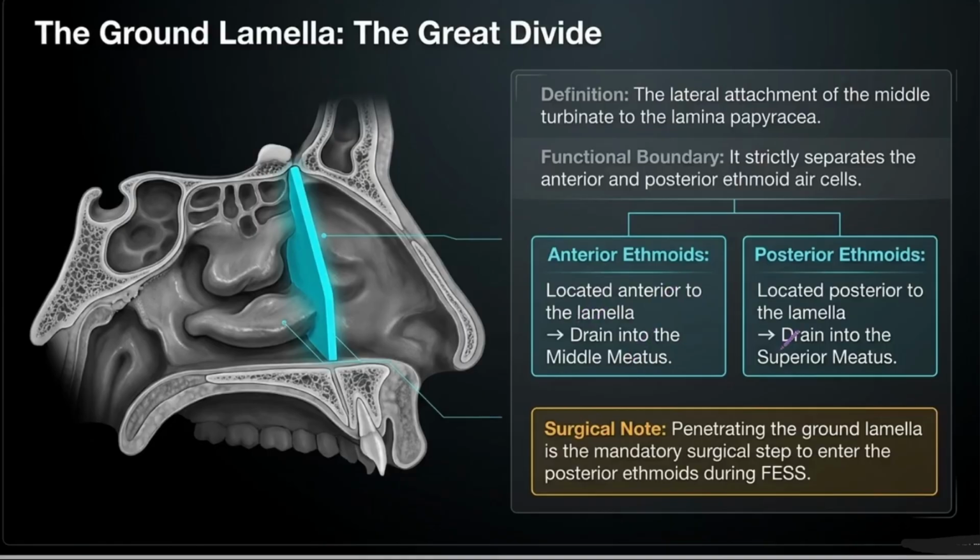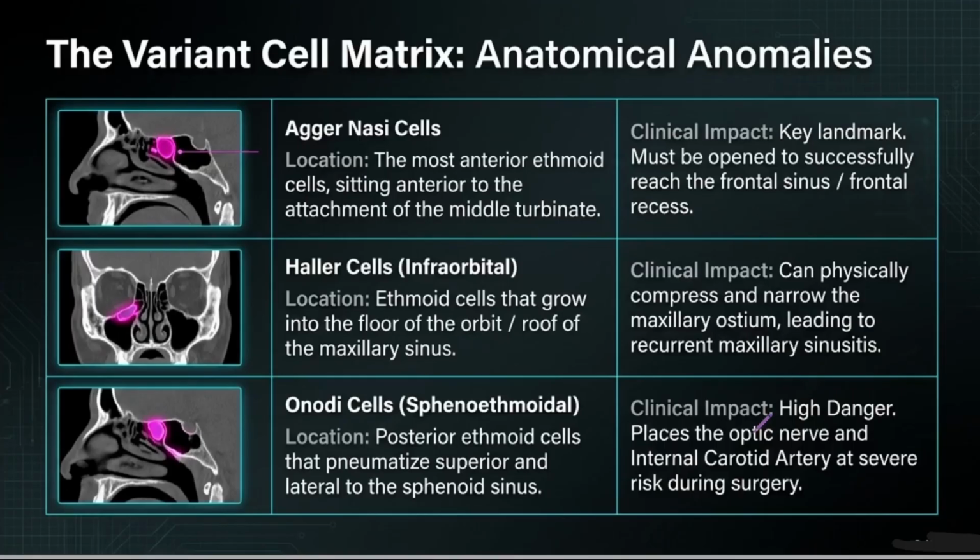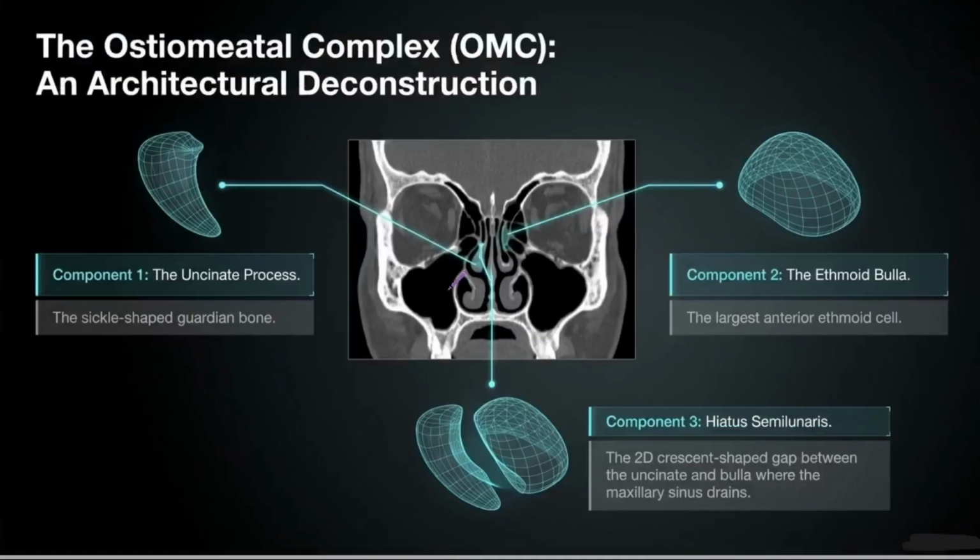Well, if we connect this to the bigger picture, it thoroughly explains the intense psychological preparation required for FESS. Because a surgeon doesn't just casually glance at a CT scan, do they? No, they literally memorize it. They fight the battle in their mind before they ever scrub into the operating room. Wow.